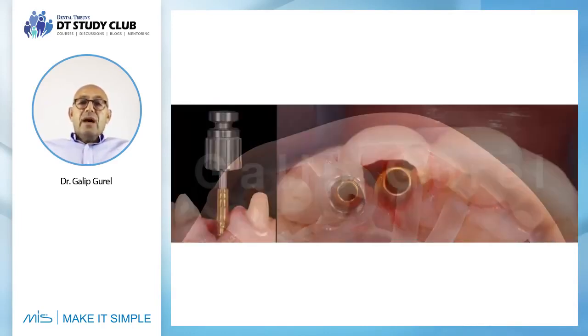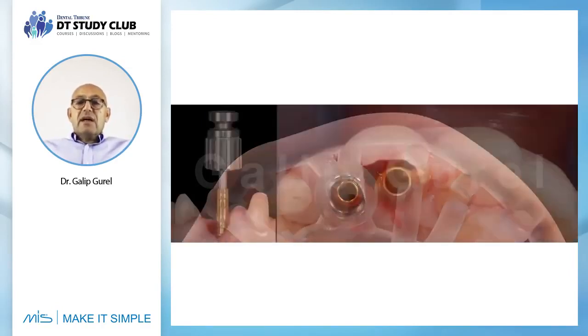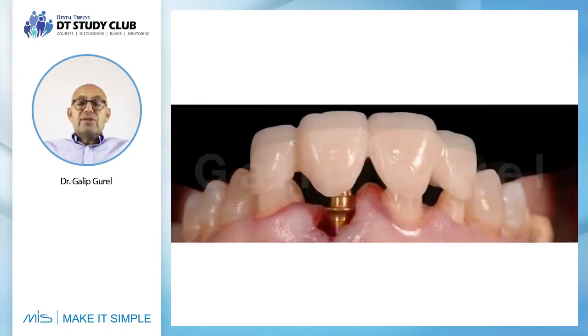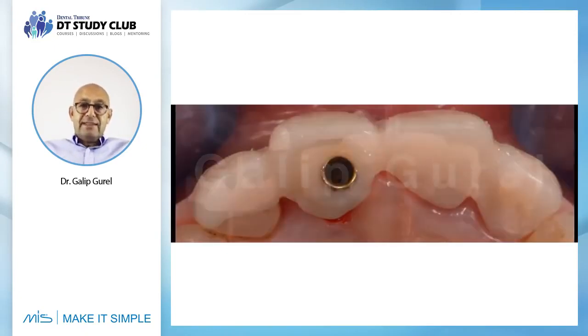So first, of course, he's placing the implant, and after that what I do is the bridge that we used to have, creating a space on the palatal side of this and trying to capture it. So as you can see, this is not fully seated, just to show you the connection in this zone.